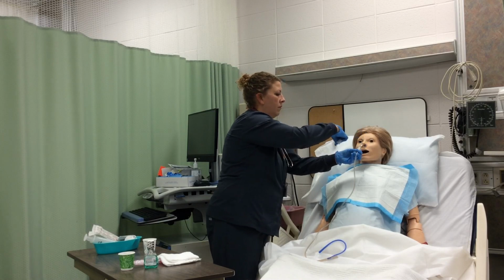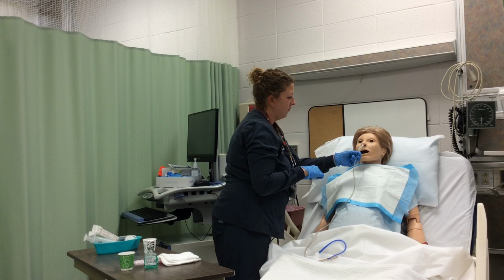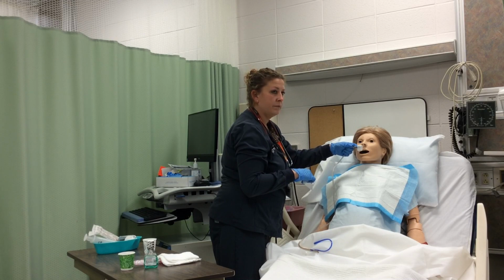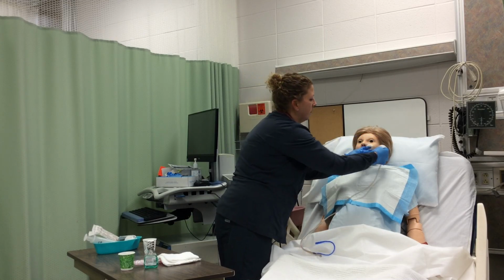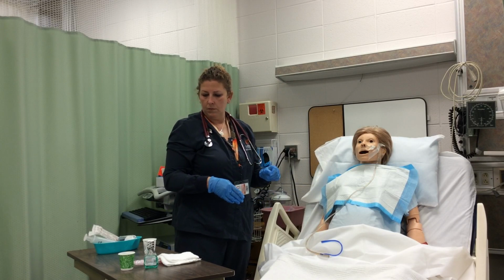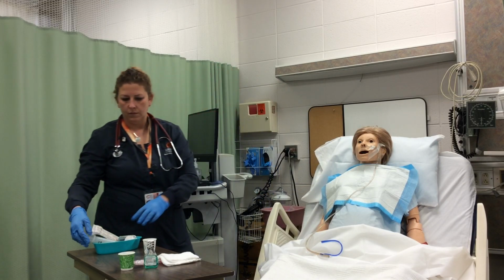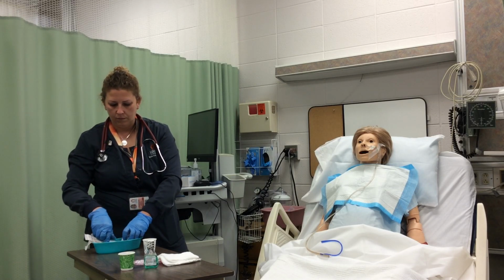Check the tube position at the back of the patient's throat with a pen light and tongue blade. Ensure the tube is not coiled in the posterior pharynx. Anchor the tube to the patient's cheek with tape. Now we're going to call and verify placement of the nasogastric tube per the organization's practice. Follow order for X-ray verification.